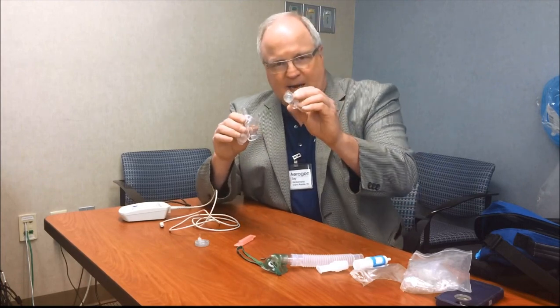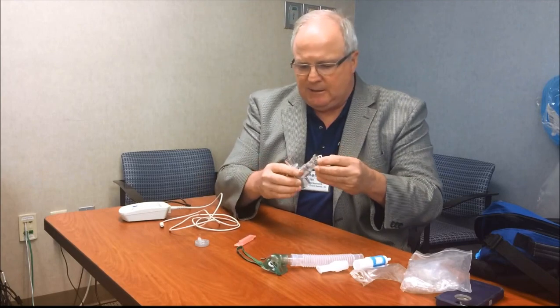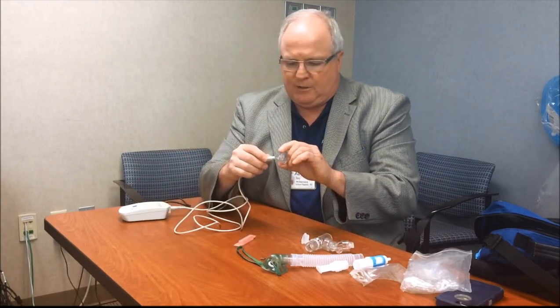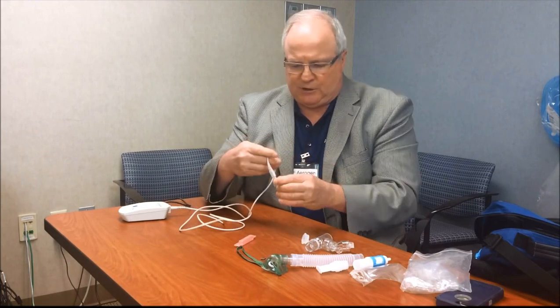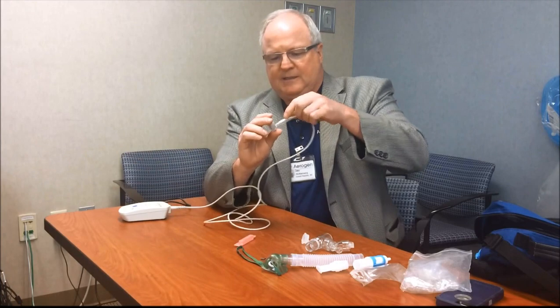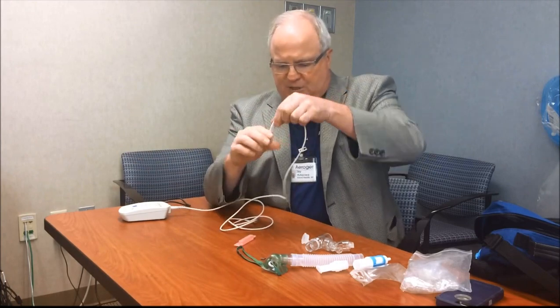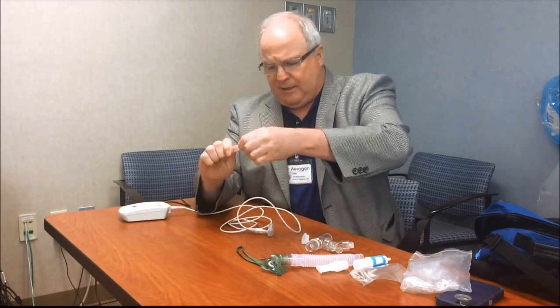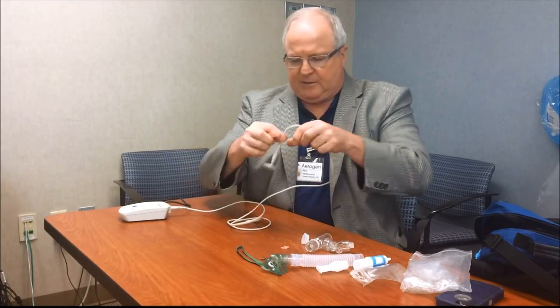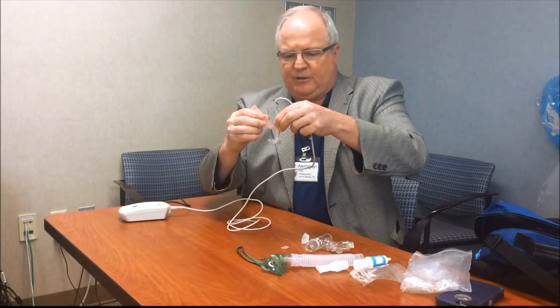If you were to look inside it, you'll see a tiny little disc. And just to demonstrate the technology, I wanted to show you what a vibrating mesh looks like. So this is actually outside of the Solo. So I'm holding a disc here that has the vibrating mesh in it. I'm going to snap a saline and show you basically the aerosol that's generated just with 1 drop.